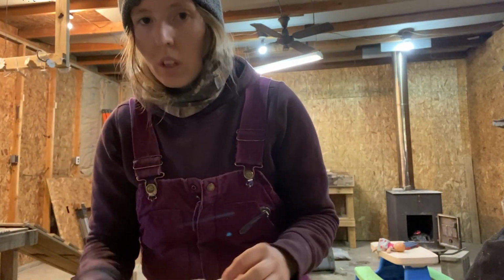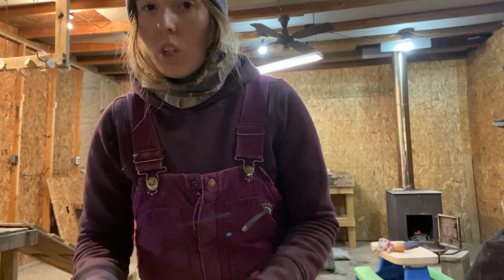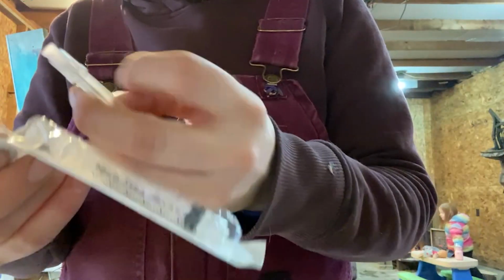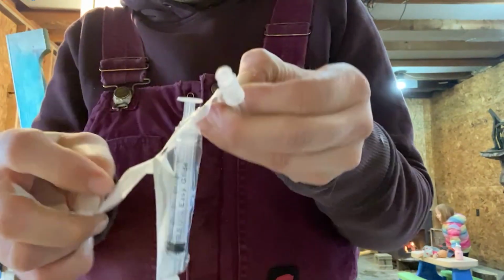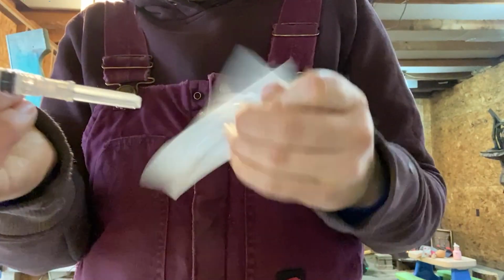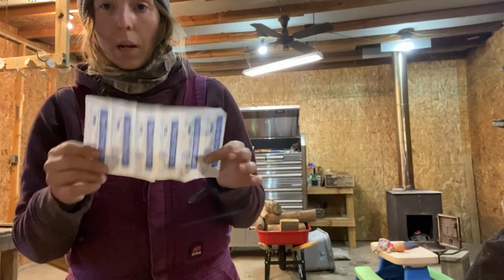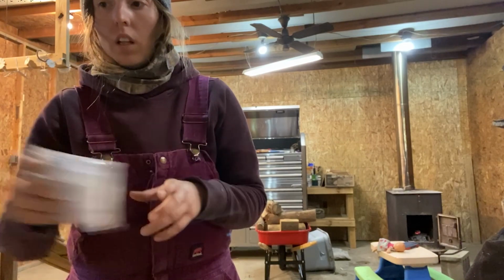Now, of course, you're testing for disease. You want everything to be accurate. You cannot share syringes or needles between any of the animals. You need sterile syringes and sterile needles for every individual animal. These are 3 cc or 3 ml syringes, and while UBRL requires 1 cc, a little extra is not a bad thing. I buy these in boxes of 100. I'll have to order more because I used a lot today.